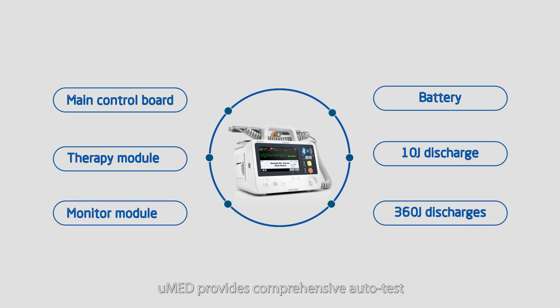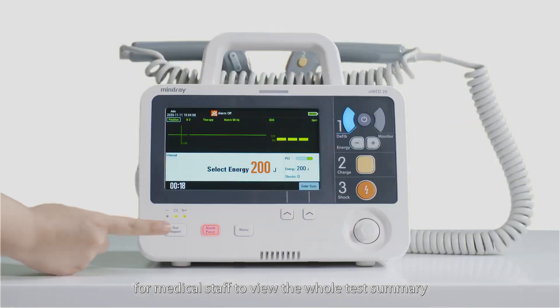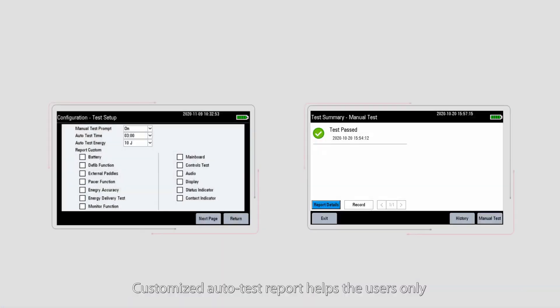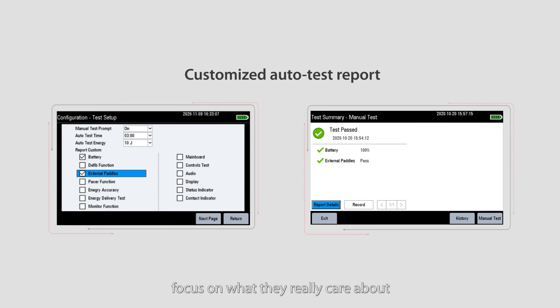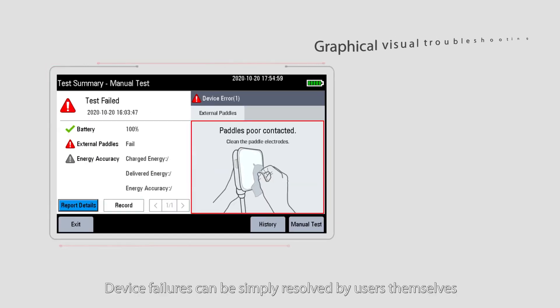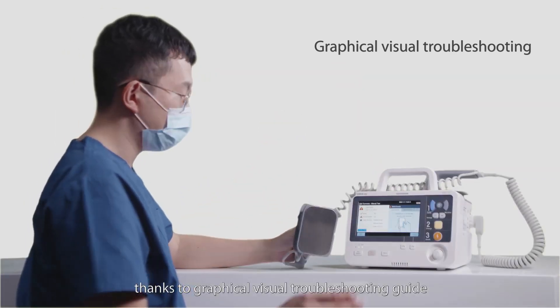U-Med 20 provides comprehensive auto test — no need for daily manual checks. Quick access makes it easy for medical staff to view the whole test summary. Customized auto test reports help users focus only on what they really care about. Device failures can be simply resolved by users themselves, thanks to a graphical visual troubleshooting guide.